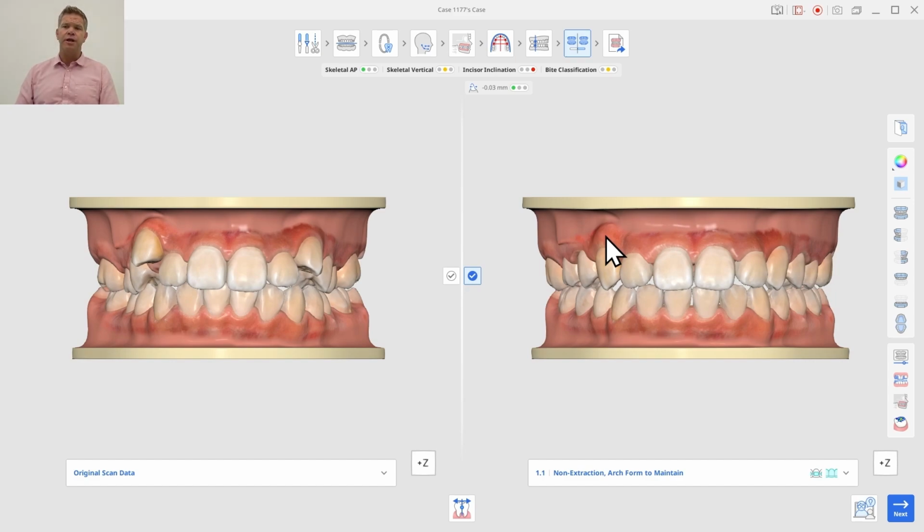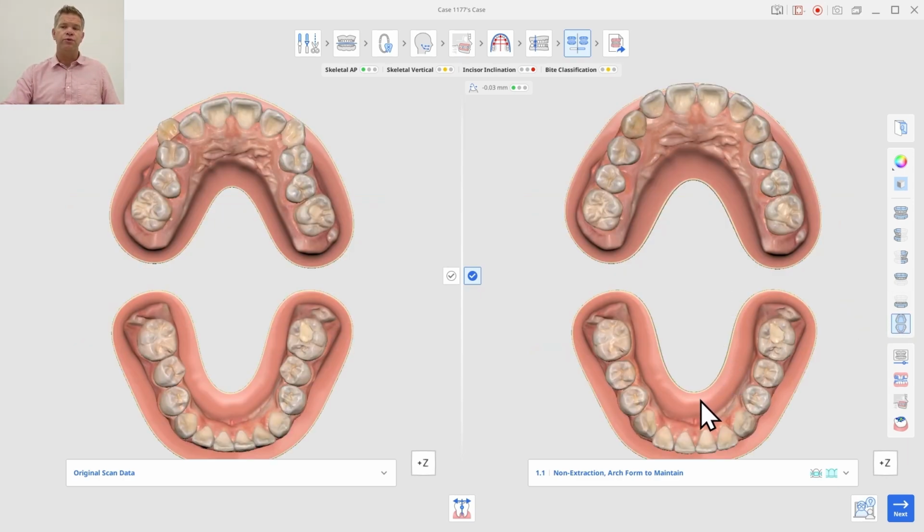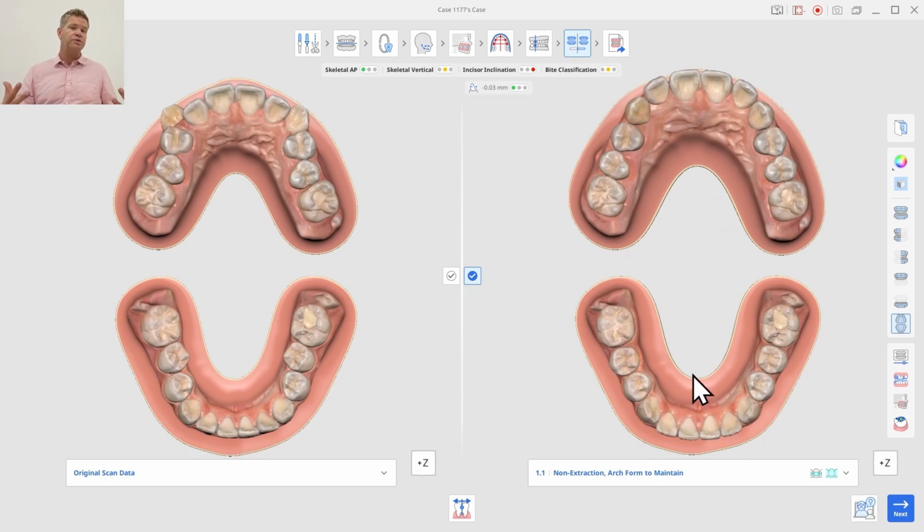Today we're going to do a training on how to do chairside diagnosis. So the hope is either you or your assistant, and hopefully your assistant, was able to go through the initial steps of how to create this simulation. Patient is now in the chair and they've just asked you to come into the room. Now this tool is a very powerful tool for you to start discussing orthodontics with the patient, educating the patient on what the treatment options are for them, and really making a treatment decision.